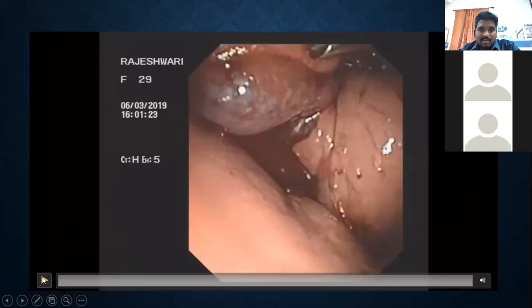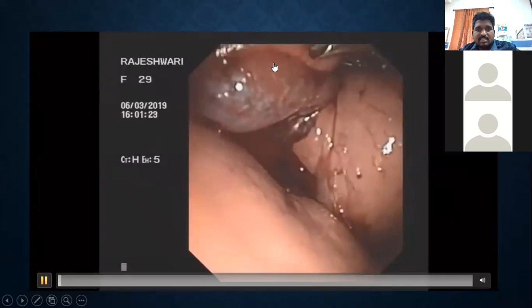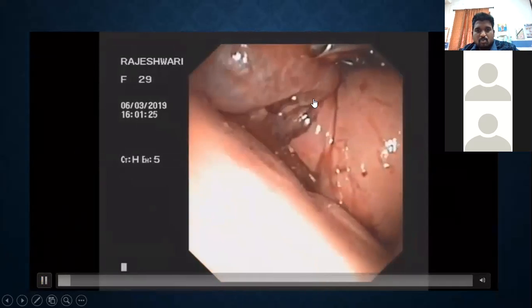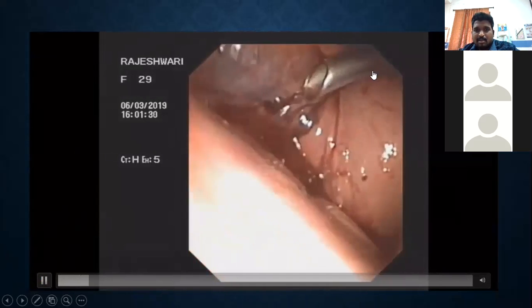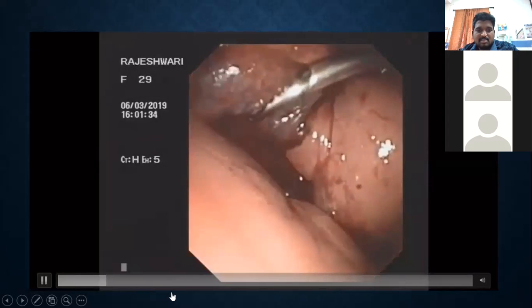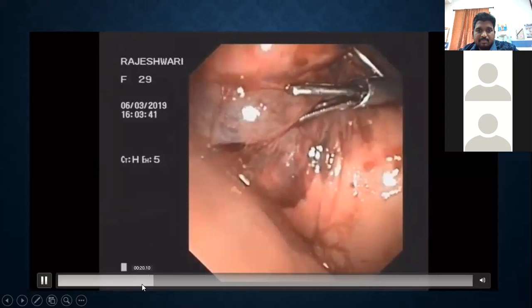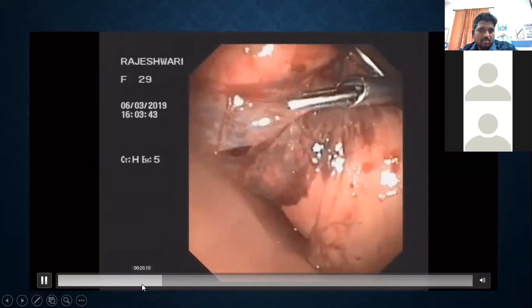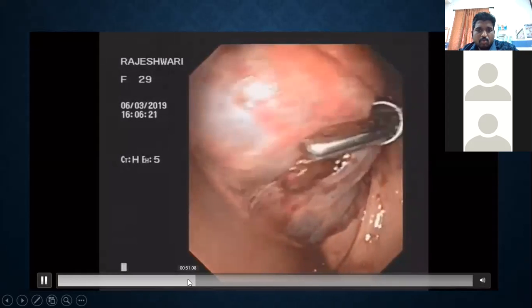So you could see a collapsed lung. This was more like a VATS. We did a medical thoracoscopy by vision, and we did 2 ports also. And you see a cyst that is just attached there. This is the diaphragm, the lung, and you could see the rigid trocar that we are seeing. This instrument is coming, and this is the cyst that we are seeing here. And this cyst is somewhat thick, gelatinous. So you could see the content of the cyst.